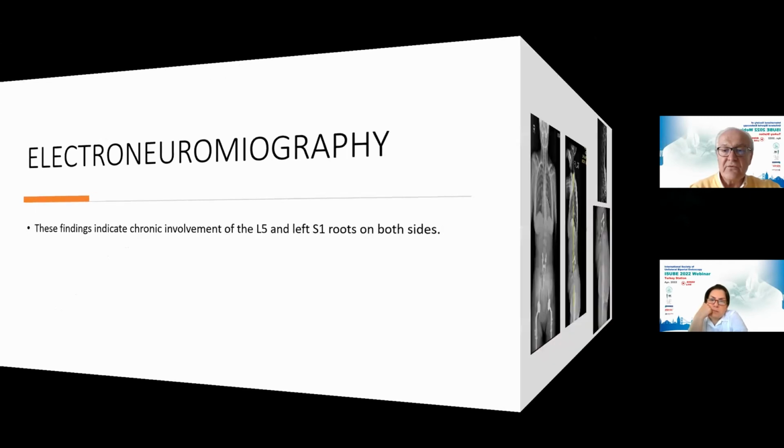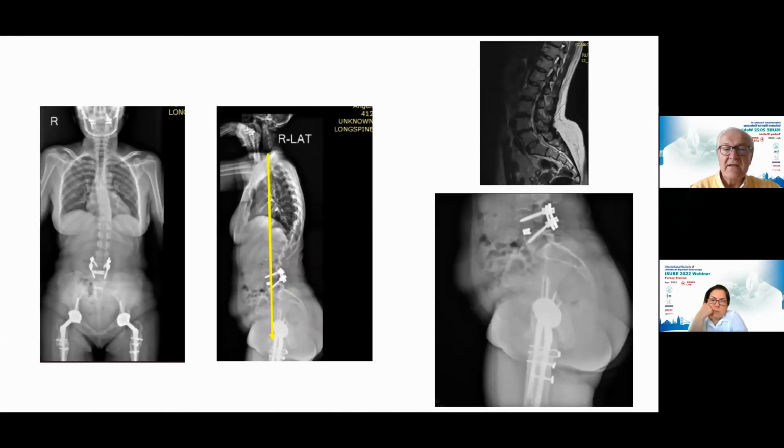And we performed for this patient only L4-5 neurologic decompression and the mechanical correction, as you see here. Of course, lumbar lordosis is less than the pathologic position on the right up, and in the middle with the yellow line, the C7 plumb line is much more physiologic than before. That's why this patient will be happy.